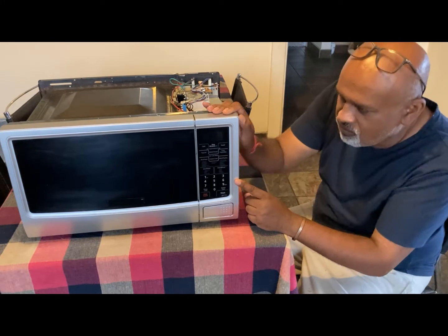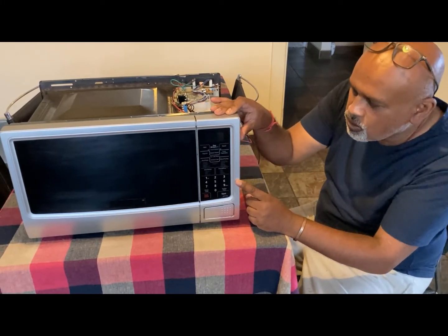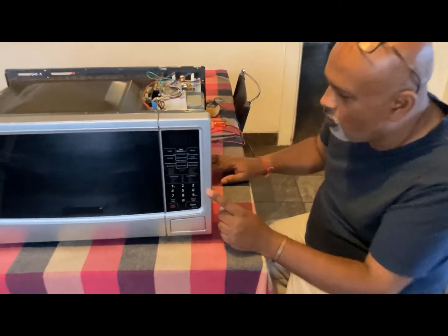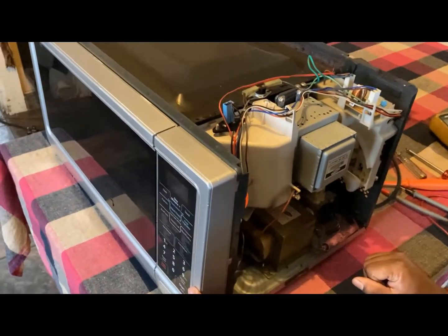So what I think I'm going to do with this microwave is convert it into a sanitizer box. But first of all, before I convert it into a sanitizer box, I want to remove all those faulty parts so that I can start with it.